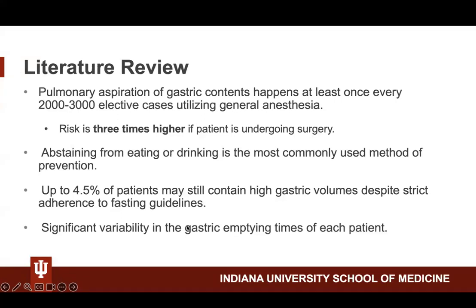Providers employ multiple strategies to prevent this from happening, including tracheal intubation, rapid sequence induction of anesthesia, or use of antacids. Notably, patients are instructed to abstain from eating or drinking during various windows of time preceding induction of anesthesia. Despite adherence to these precautions, there is evidence suggesting up to 4.5% of patients may still contain food or high gastric volumes, putting them at risk for aspiration.